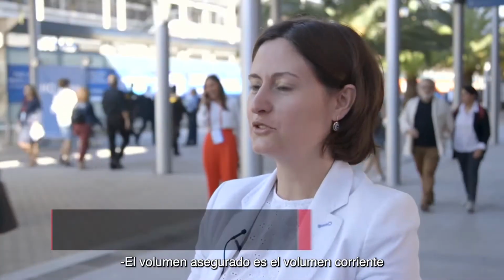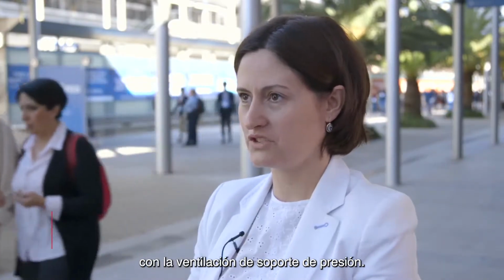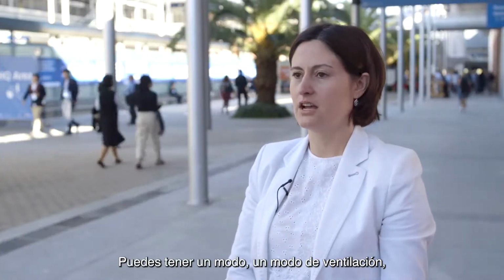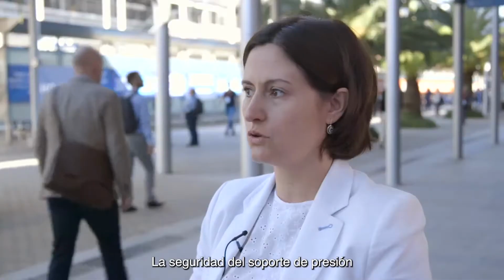So target volume is the tidal volume or alveolar volume that you want to achieve with pressure support ventilation. You could have a ventilation mode that offers a guaranteed volume with the pressure support. So, the safety of the pressure support with the efficacy of the volume.